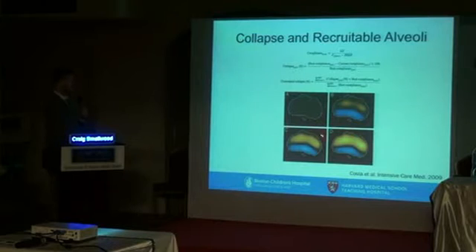And then finally here, I mean, all orange, that seems really bad, and we wouldn't want to keep our patients there, because clearly if we overdistend them for long periods of time, we're going to be subjecting those areas of the lungs to volutrauma, barotrauma, ventilator-induced injury, potentially manifesting as a gross pneumothorax, which would be really bad, or a more subtle and long-term injury to the lung, which could prolong ventilation in our newborns who are especially susceptible.